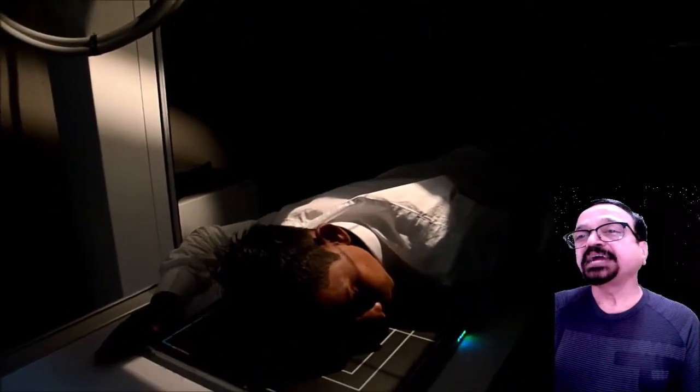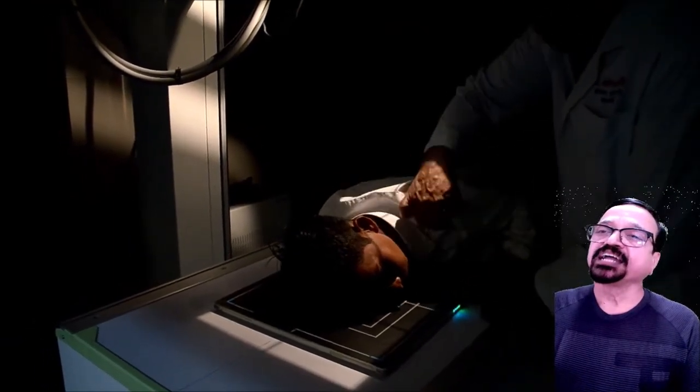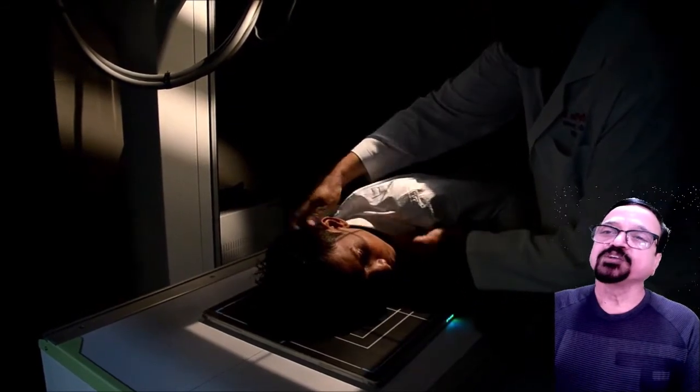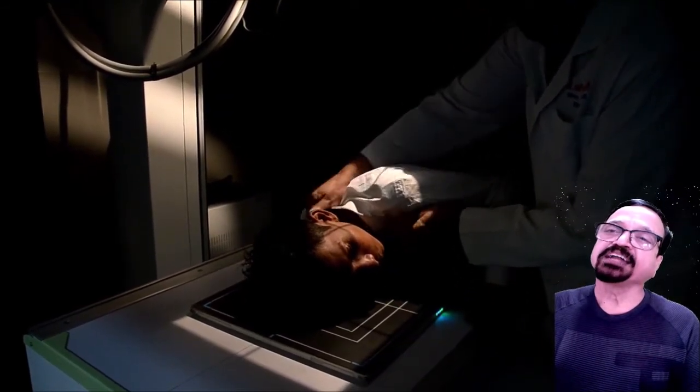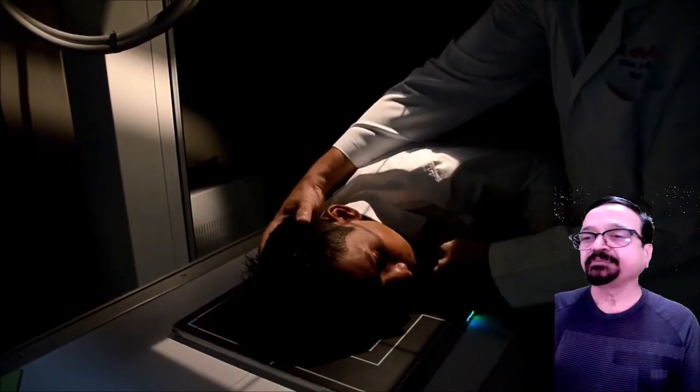Now the angle is made over the TM joint. The patient's affected side is towards the cassette. Now see, we are seeing the comfort of the patient. If the right side is up or right side is down, then patient rotation may not be complete. So we ask the patient to keep one hand down and one hand resting over the table so that he can be fixed.